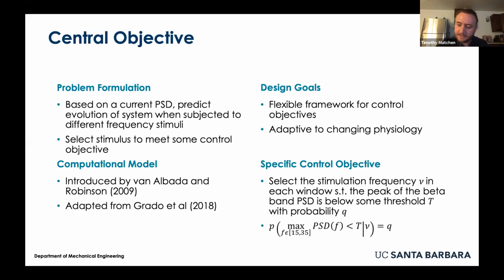So unlike the previous problem where we wanted to do something that was just descriptive, this is instead a prescriptive problem where we're trying to actually select a control stimulus. And we're going to keep updating our model and continuously train our model to respond to errors that it's seeing and try to match the values so that we're going to hit a specific probability Q.